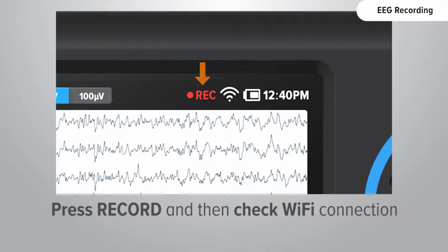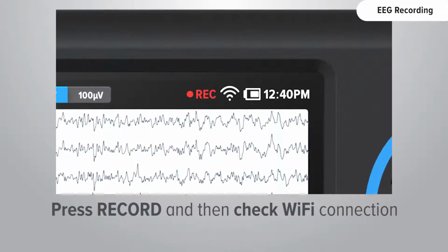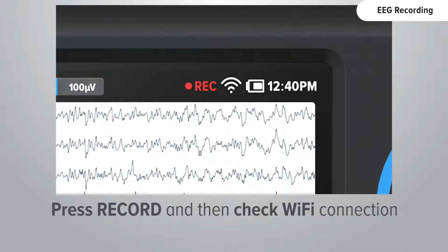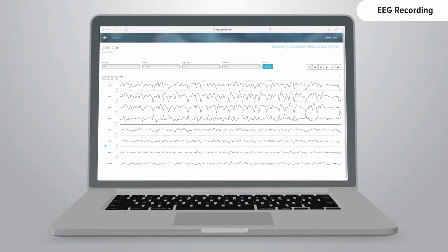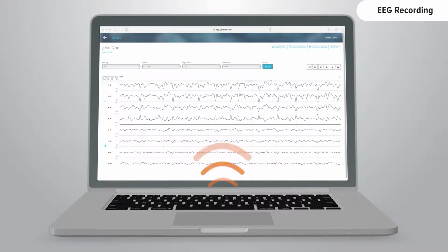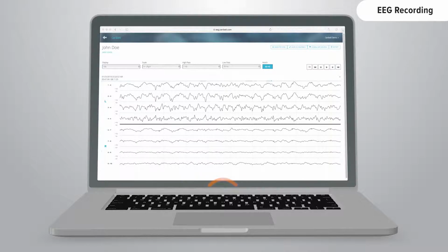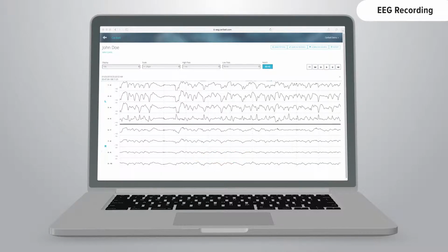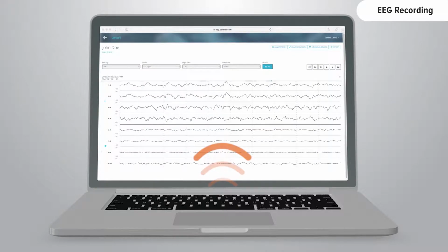Verify that the Record and Wi-Fi icons on the screen indicate that the recording and Wi-Fi are both on. When connected to the hospital Wi-Fi network, the Ceribell recorder streams EEG data in real time to a secure cloud server. Physicians can access the portal anywhere with an internet connection and authorized access.